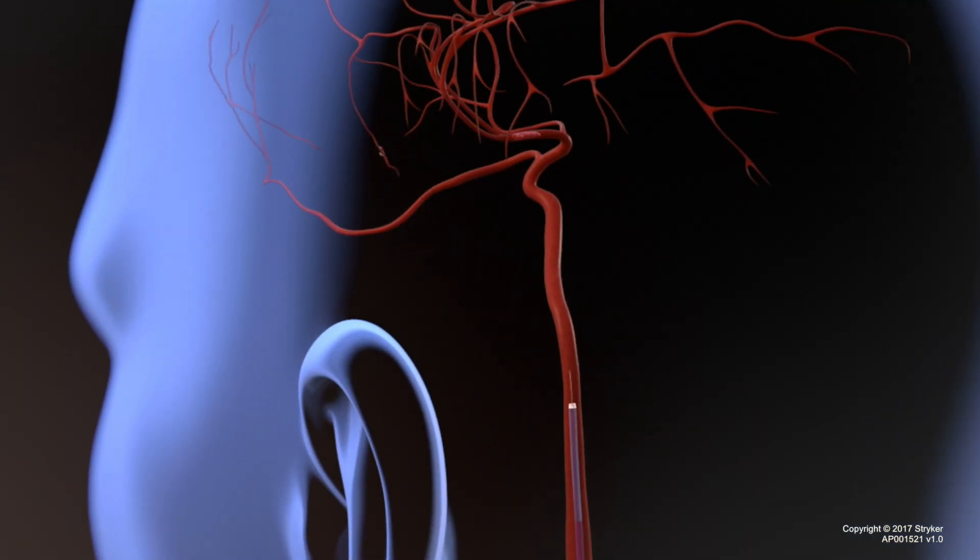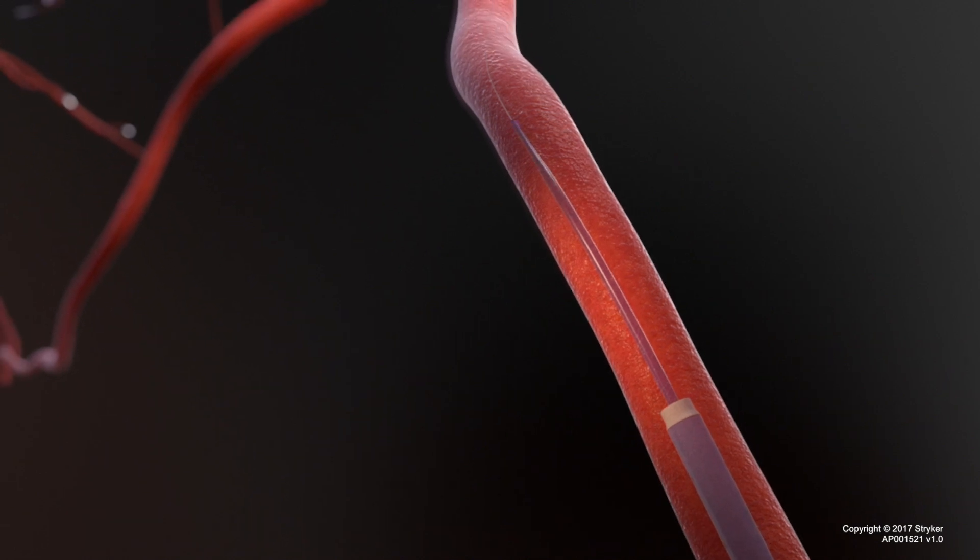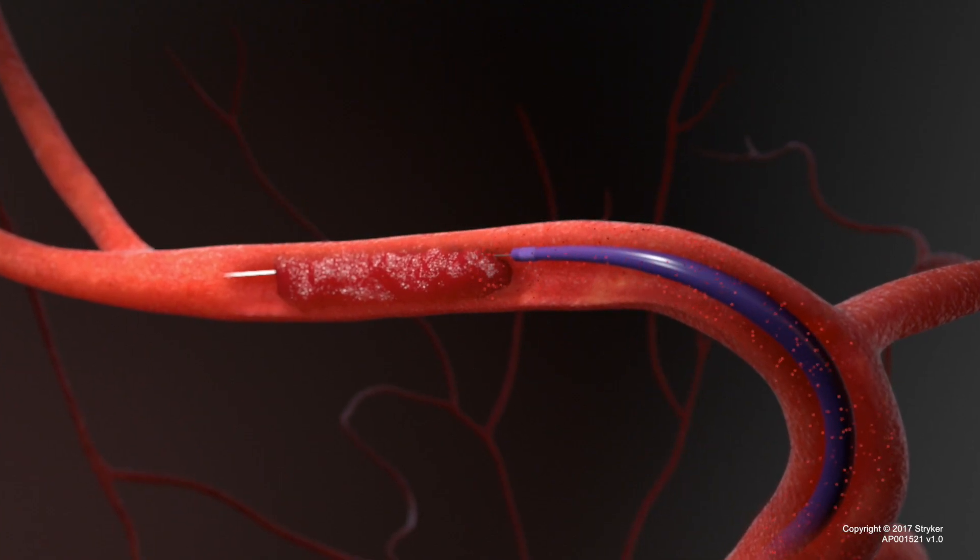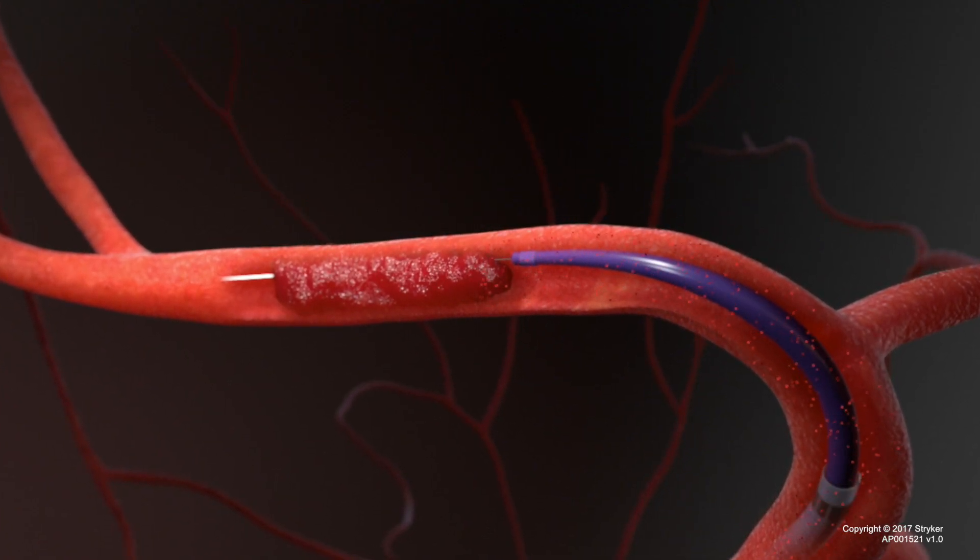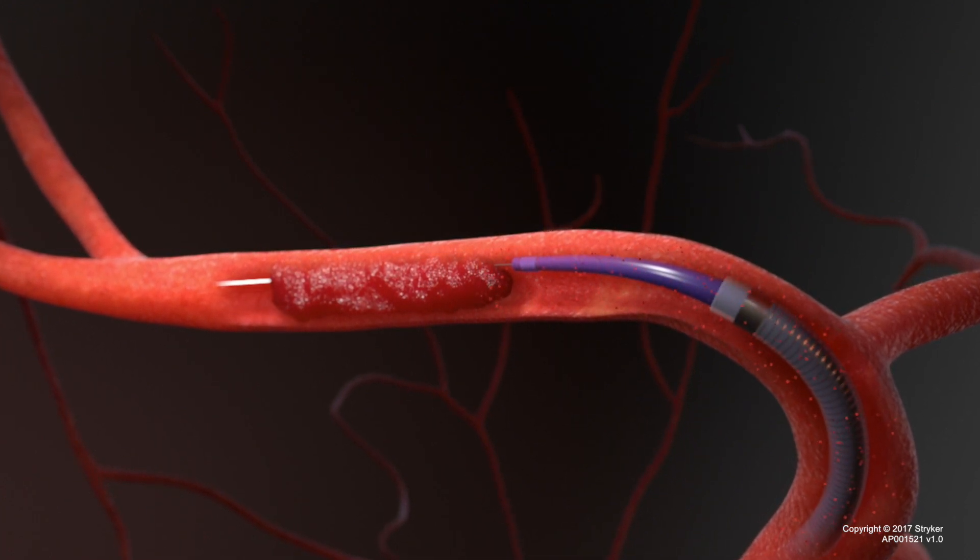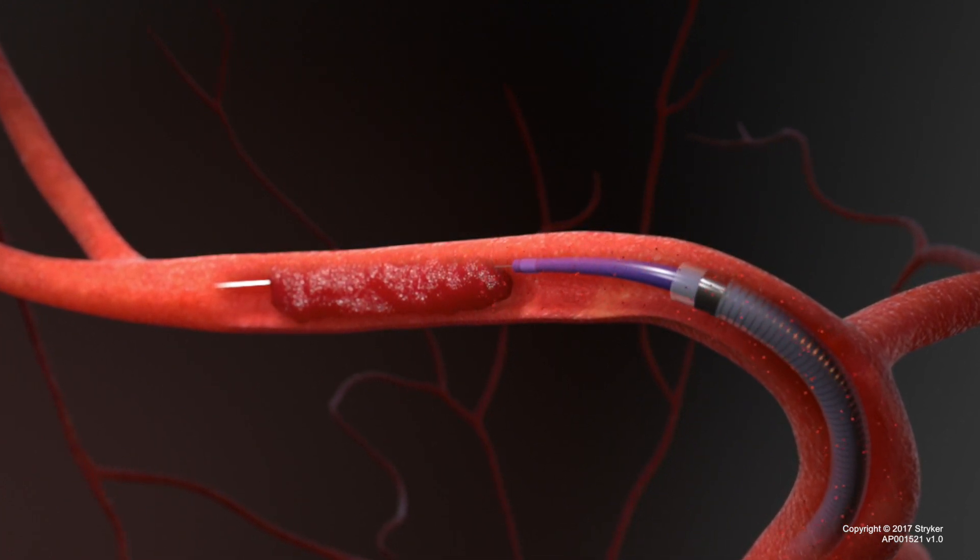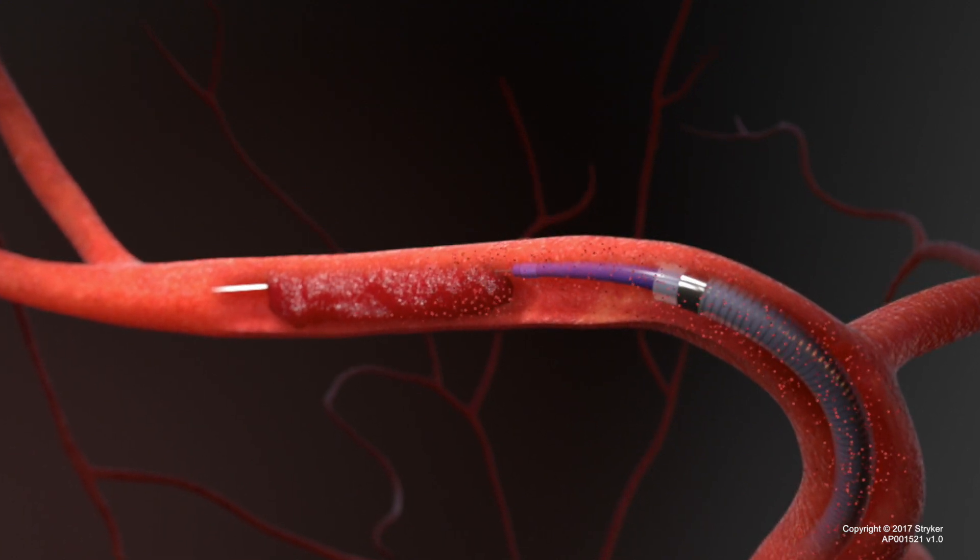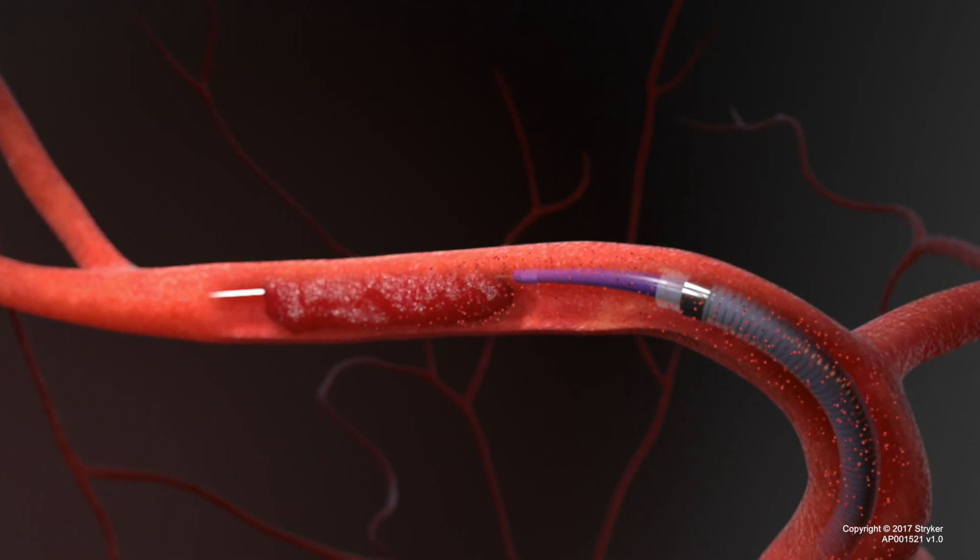After gaining access with a balloon guide catheter, advance an aspiration catheter such as the Catalyst Distal Access Catheter over the offset delivery assist catheter and guide wire to the site of occlusion. Position the Catalyst Distal Access Catheter just proximal to the occlusion.